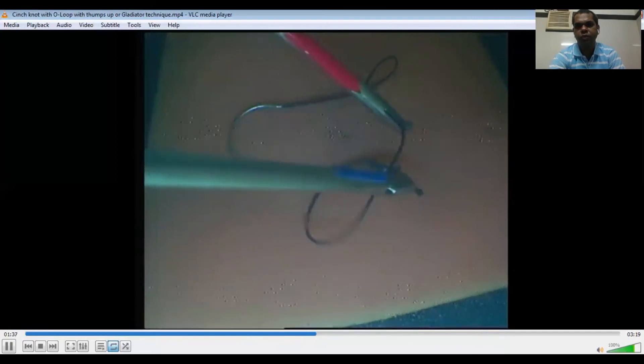Now this is again the demonstration of the thumbs-up technique. This is again the O-loop with under wrap. This is the O-loop — this is the connection of the left needle holder making the O-loop. Now I will share another video of the sliding square knot.